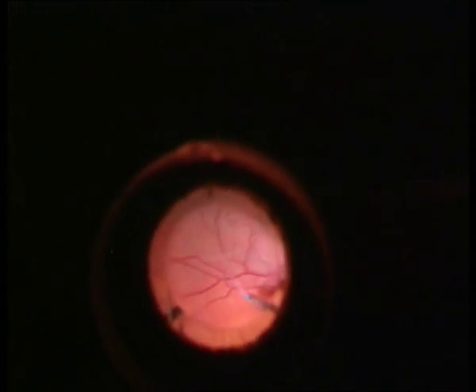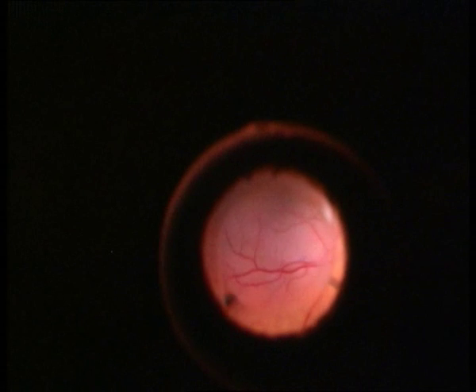The shadow of the instrument will give us very useful information about the instrument's regular distance.